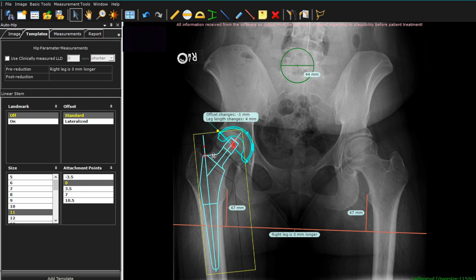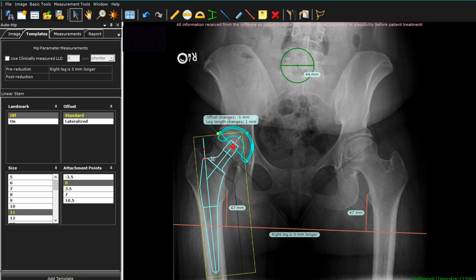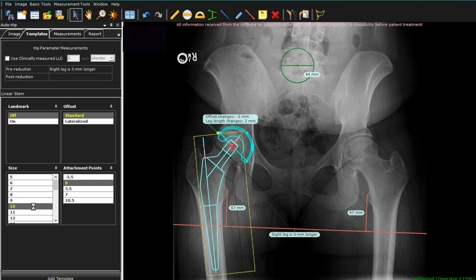We want to adjust this down just a little bit, and you can see the numbers change for the leg length when you do that. The same is true with offset if you move it medial or lateral, and the yellow dot at the top of the yellow box will allow you to change rotation. This stem looks a little large at size 11, so I'm going to go down to a size 10 and get a little bit better fit here.